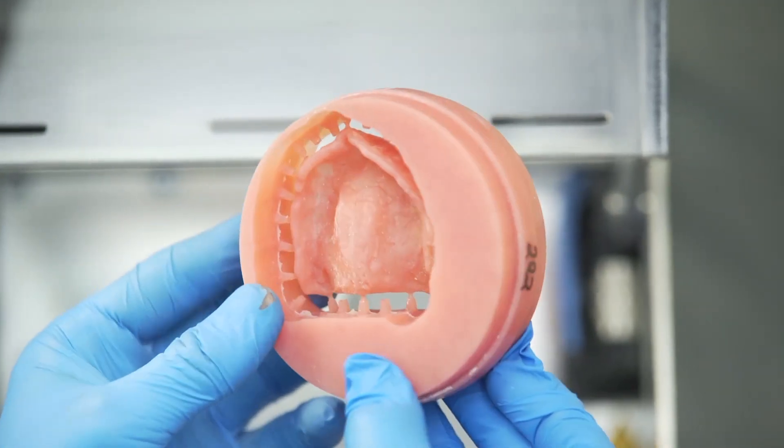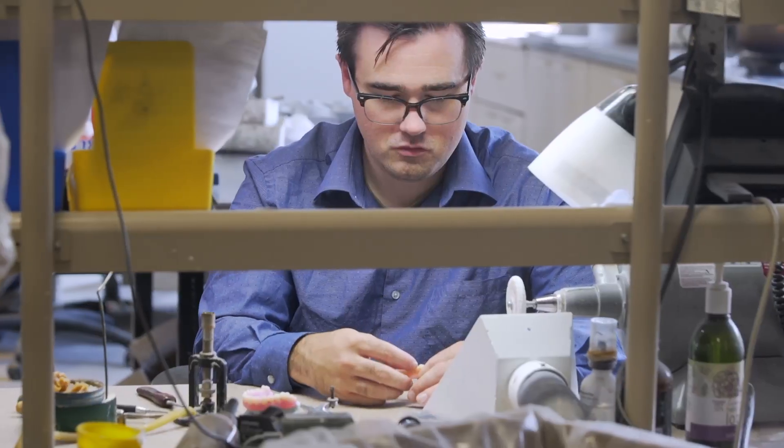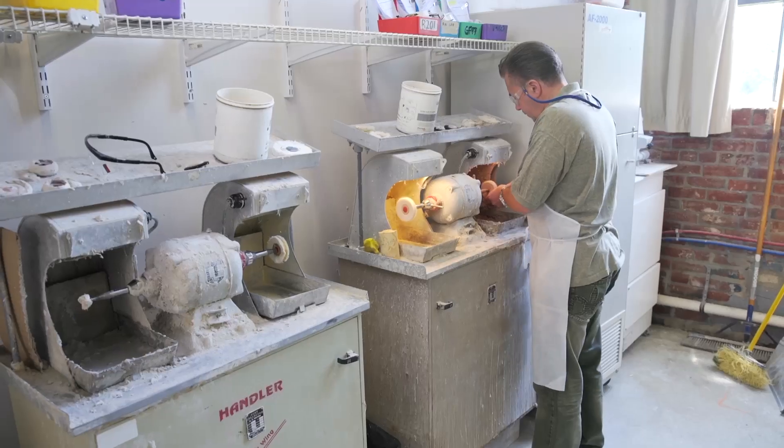We've been using the Keystone Industries Key Mill denture base disc, which has really been improving our efficiencies, cutting out our traditional process times. We lowered costs and still have the same beautiful and effective product as traditional materials.